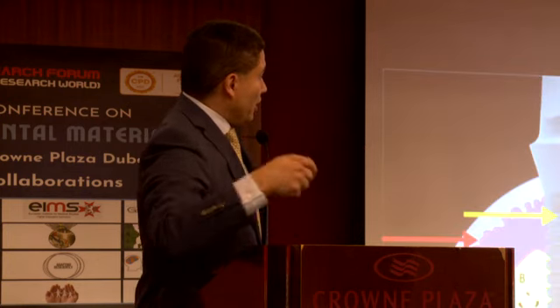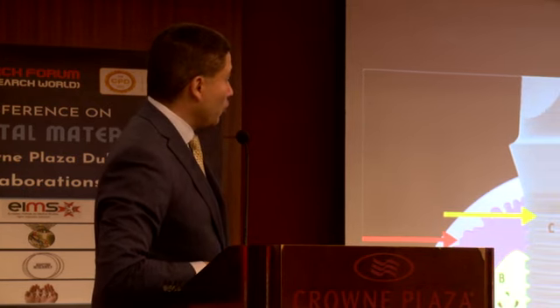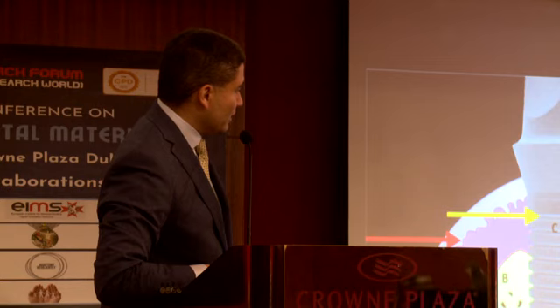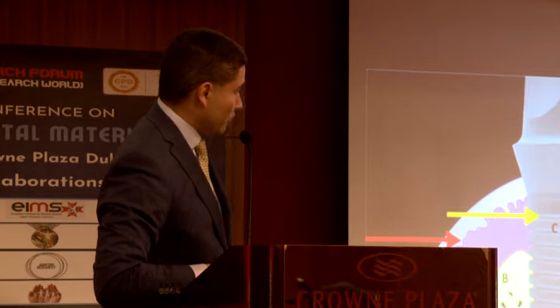This is explained by this picture right here by Canullo and co-workers in 2011. If you see, in this case, on the right side, the platform of the abutment is in the inner aspect and the platform of the implant is reduced in here, which allows the soft tissue to migrate into this area of the platform and to protect the bone better.